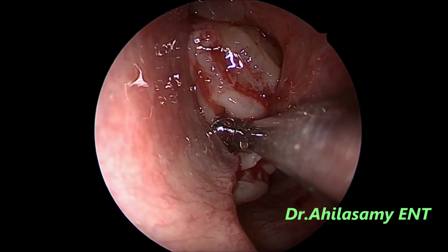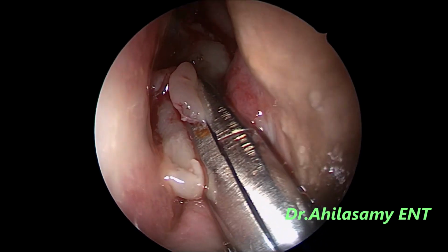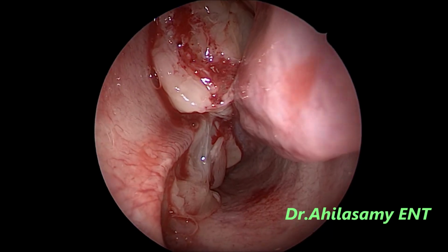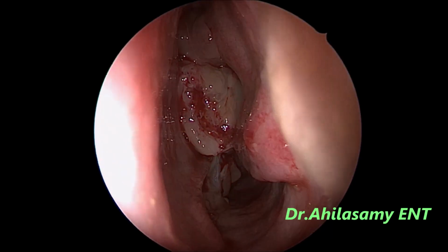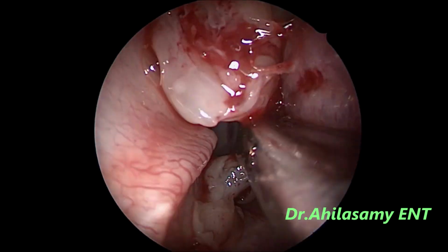I am taking multiple biopsies because many people thought that it's an inverted papilloma, but I have to prove that. Clinically, it doesn't look like inverted papilloma, but still we have to biopsy the patient.